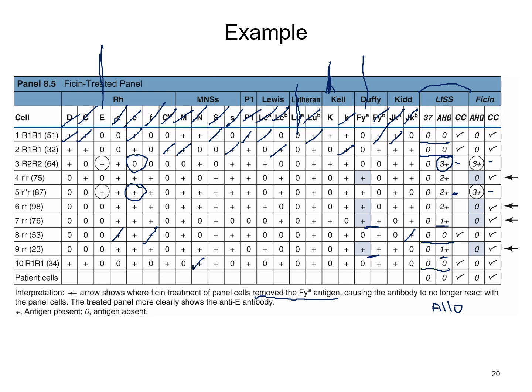So when you treat it, you're actually removing those antigens that are on those cells. So essentially, you're making all of these now antigen negative. And I'm sorry, I didn't even pay attention to the fact this one is positive, so you've got some overlap here with this particular cell where you've got positive reactivity for E and for your Duffy.